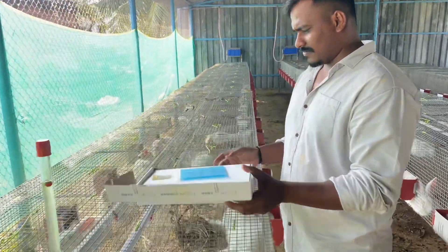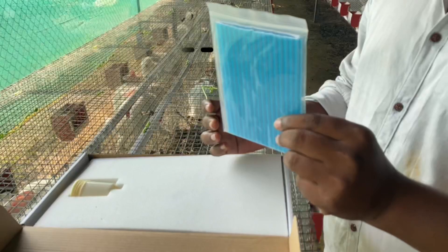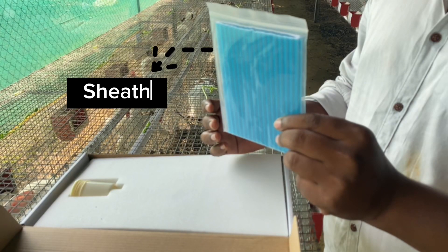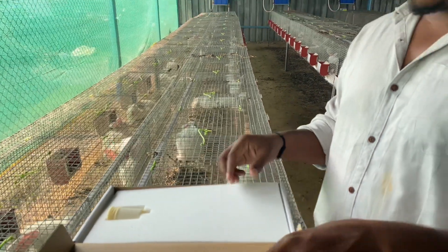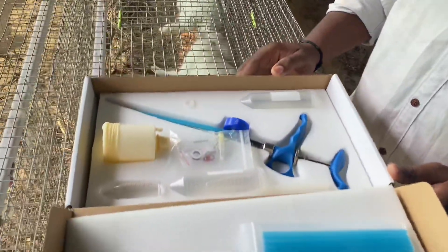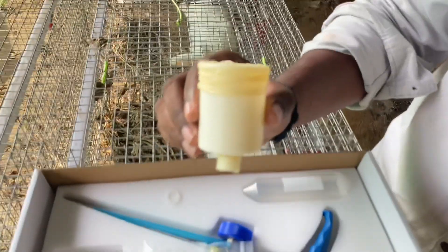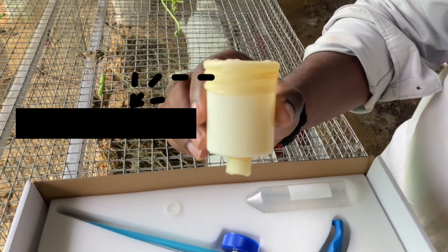Let's unbox the AI kit. By opening the box we have a sheath and an artificial vagina.